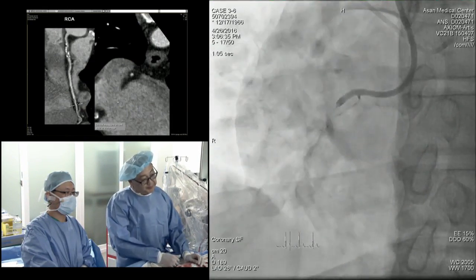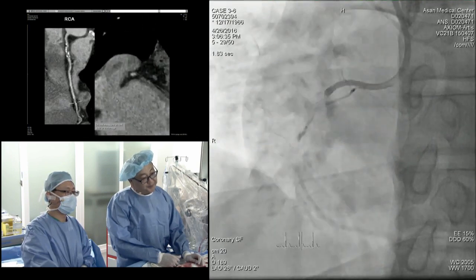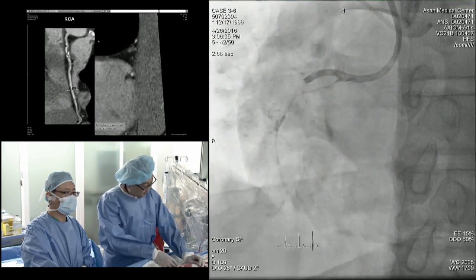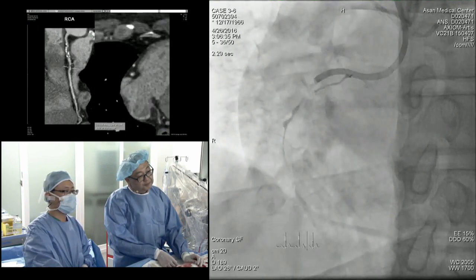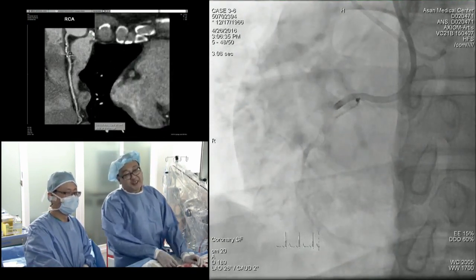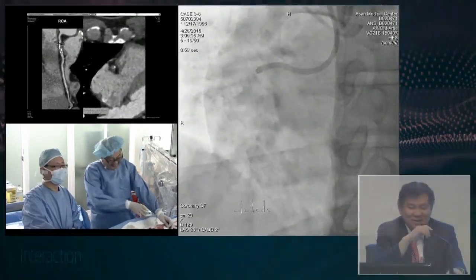Okay. So you asked which wire? Yes. So there's some moderator comment. Dr. Lee, this is not a CTO, real CTO, right? No, no, CTO is right. As you can see, this is a CTO live demo.